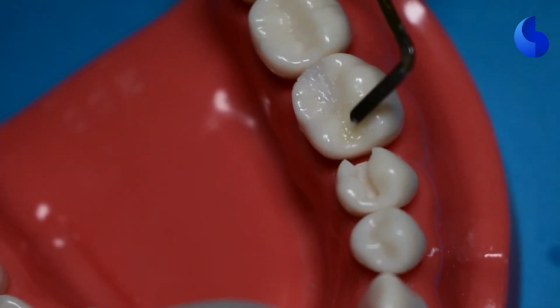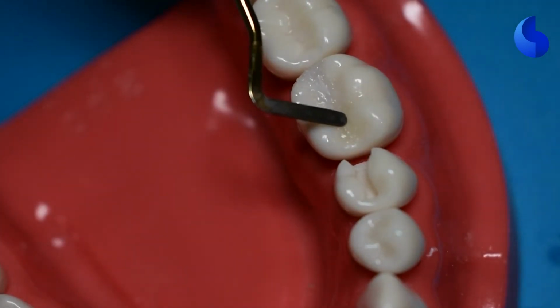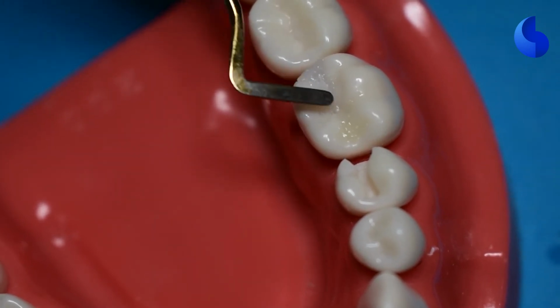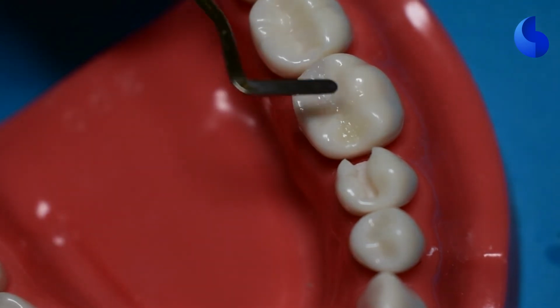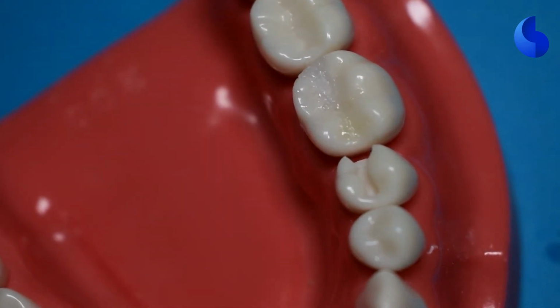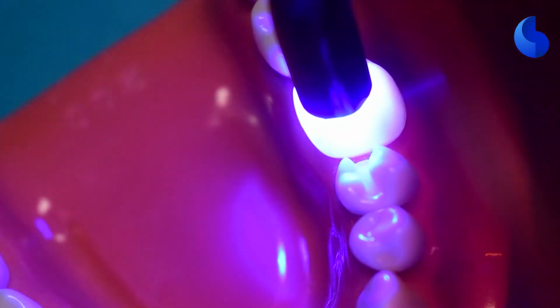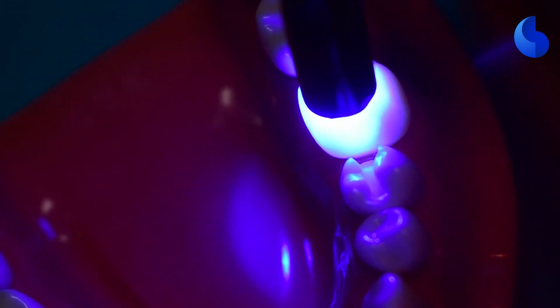When condensing additional composite onto the occlusal aspect of the cavity, you'll notice how we condense it. We're placing the plastic instrument flat against the cusps and the grooves. This helps you create that initial anatomy that we're looking for, instead of just adding material flat onto the occlusal surface.